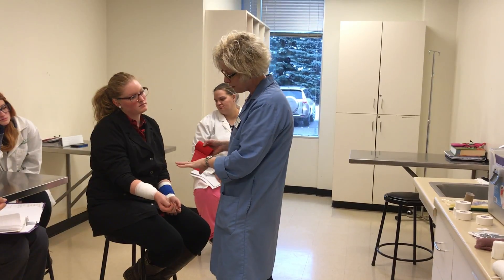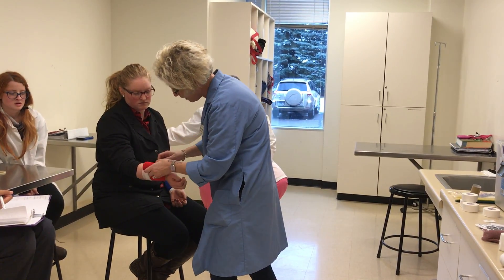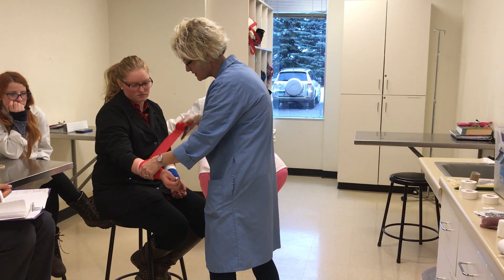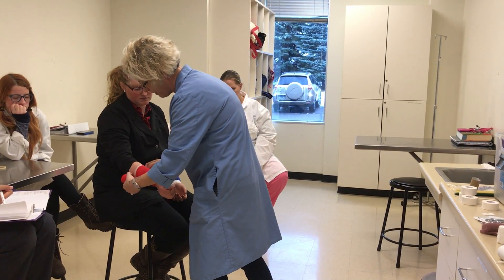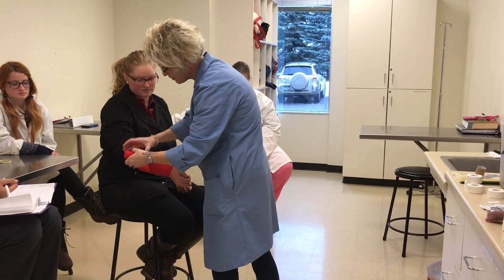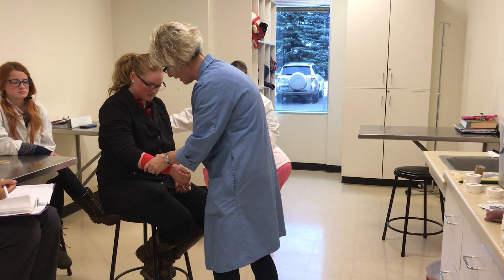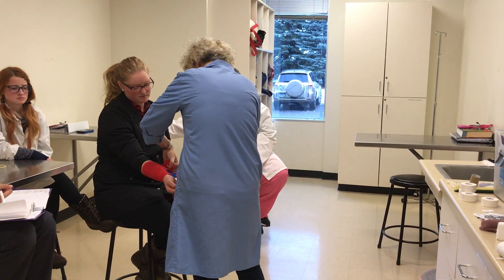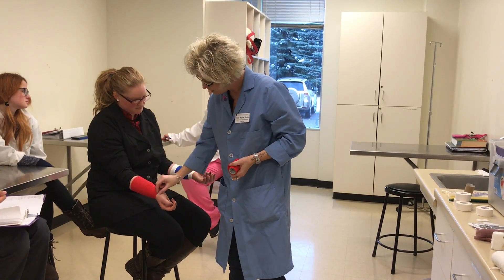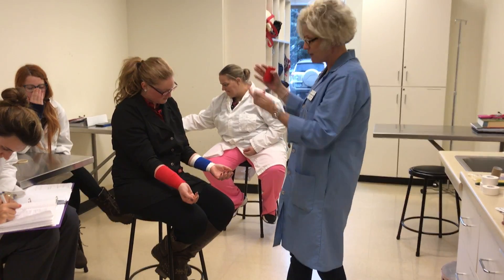When you put the vet wrap or elasticon over the primary and secondary layer, you have to cover it completely. If any of that secondary layer gets wet from the outside environment, you'll have to change the entire bandage — whereas if only the vet wrap gets wet, you would just change the vet wrap. If I need more vet wrap I can roll it, but I don't want to wrap it with all that tension because then it would be significantly too tight. It sticks to itself. For added security you could put a layer of tape proximal and distal, but based on your primary and secondary layer it shouldn't be needed.